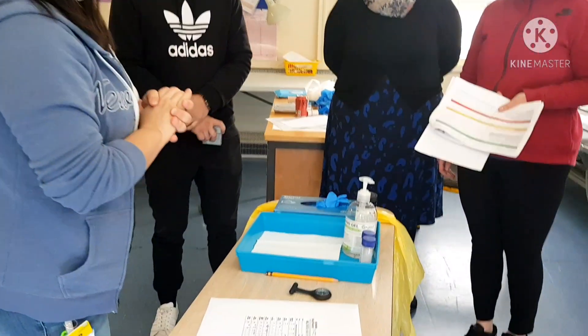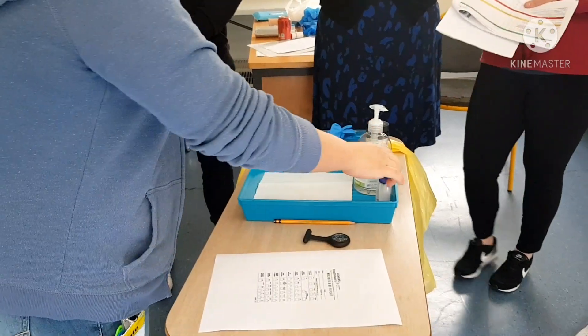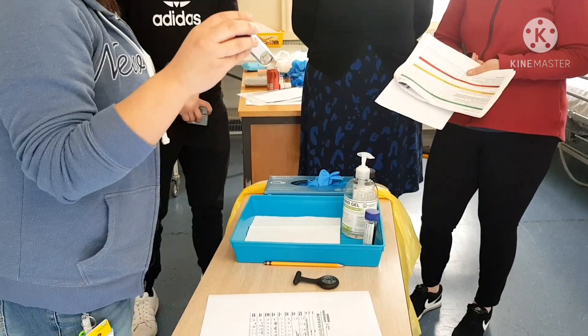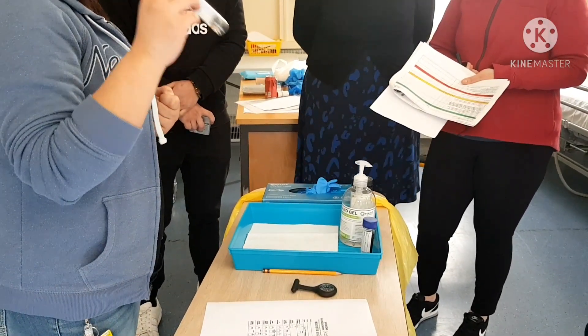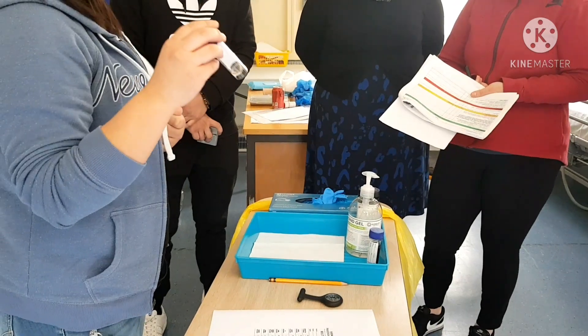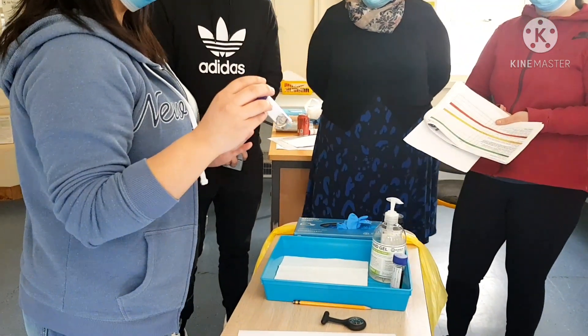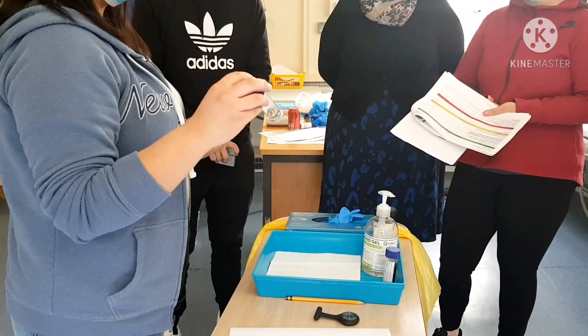Since my patient has already been identified, I'm going to hand this urine collection bottle to my patient and instruct them to collect a urine sample. But prior to collecting the sample, I will strictly instruct my patient to wash the perineal area with soap and water and pat it dry from front to back, especially for female patients.